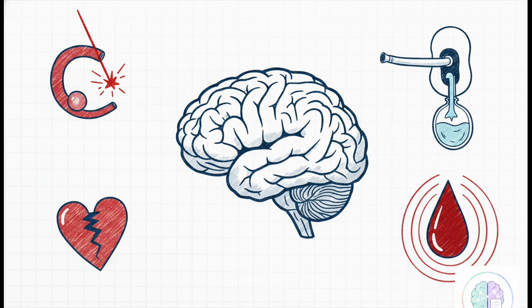Beyond the nerves and hormones, the vascular risks are severe and potentially life-threatening. Just millimeters below where the fenestration is made sits a highly complex vascular network. We're talking about the potential for catastrophic injury to major vessels like the basilar artery, the posterior communicating artery, or the posterior cerebral artery. Now here's a fascinating but honestly terrifying detail. There is a specific risk of a traumatic basilar artery aneurysm forming due to thermal injury if a laser is used to make the stoma.